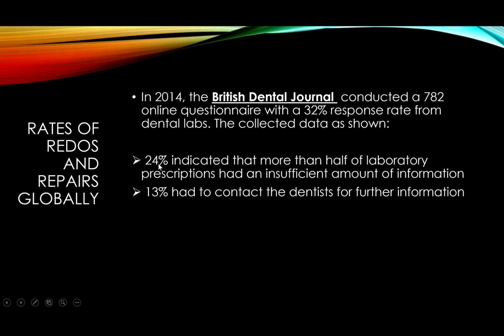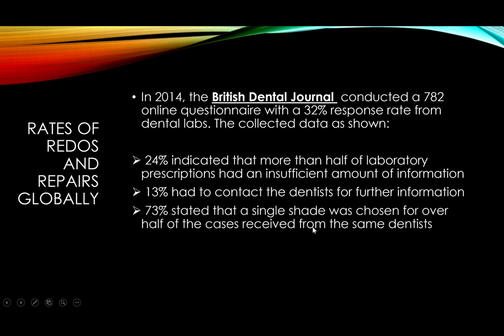There's no excuse for sending a prescription that's lacking information, but if you receive it as a dental lab technician, it's your duty to pick up the phone and talk to the dentist, ask them, send a WhatsApp, or initiate any kind of communication channel, and not start working on the case without having enough information on the matter. All right, 13% had to contact the dentist for further information.